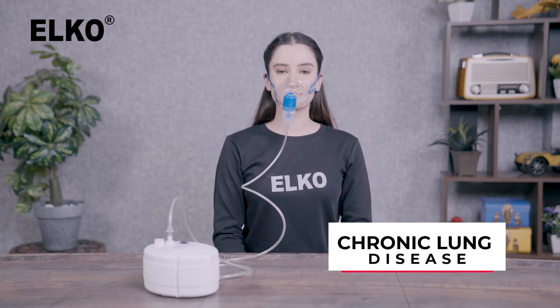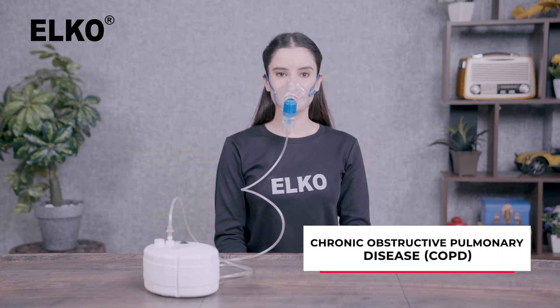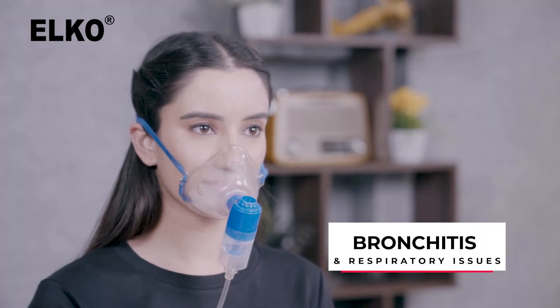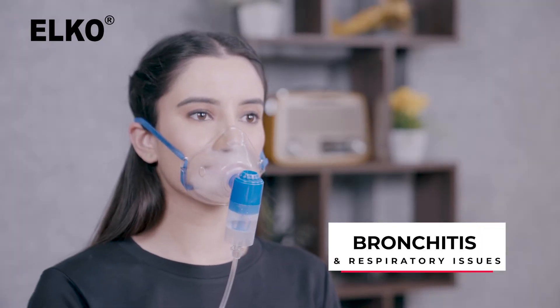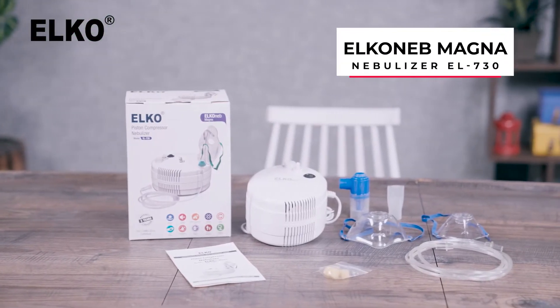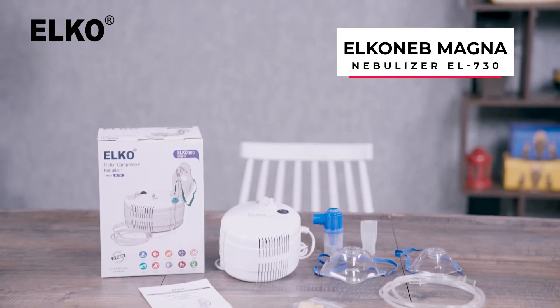Many people with chronic lung disease such as asthma, chronic obstructive pulmonary disease, bronchitis, and other respiratory disorders use nebulizers to take their medicine in the form of a mist. Introducing the ELKOneb Magna Nebulizer EL730 by ELKO.